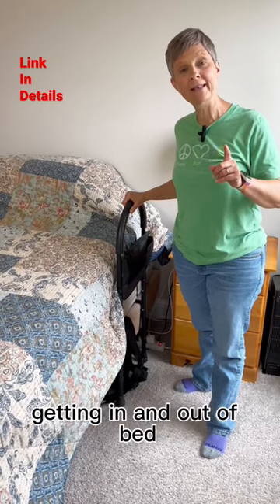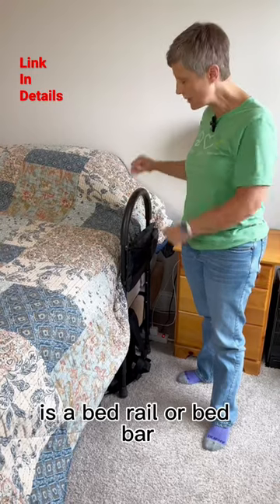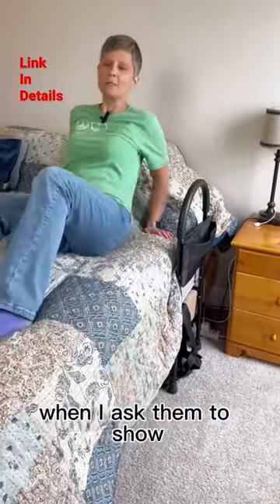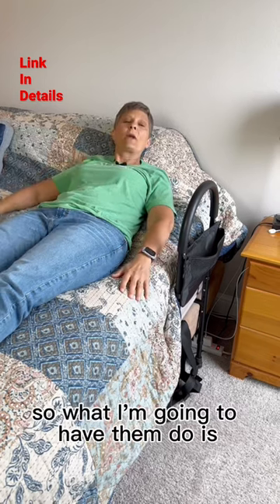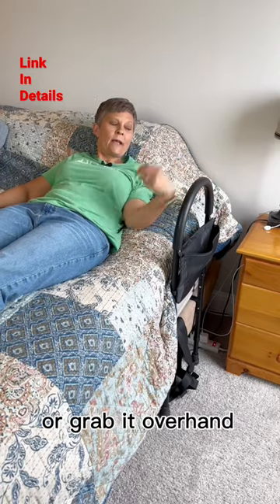When I see my clients struggling getting in and out of bed, the first thing I will recommend is a bed rail or bed bar just like this. When I ask them to show how they're getting in and out of bed and they start grabbing for the covers, I know this might help them. When they're in the bed, they can either grab it like this or grab it overhand.